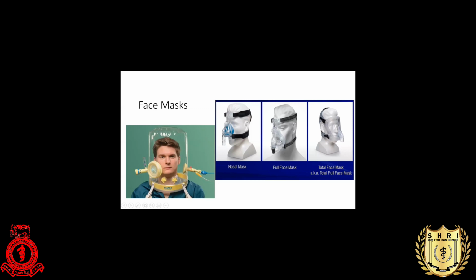Because of that, if you use a proper mask, that will prevent unnecessary leaking, and you can give the patient your target setup. Before starting this, you have to explain to the patient what you are going to do, otherwise the patient will become very anxious. Another thing is you have to keep this mask on the patient's face once you start the machine, without putting on the strap, and allow the patient to get used to it. After the patient gets used to it, you can fix the straps.